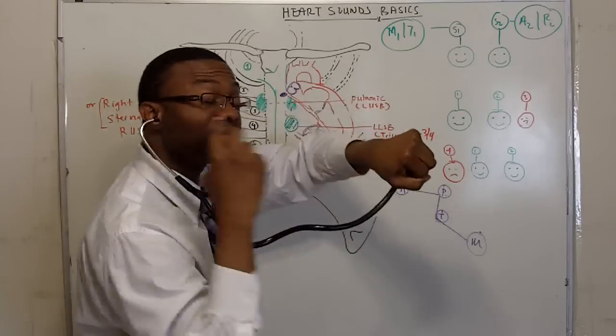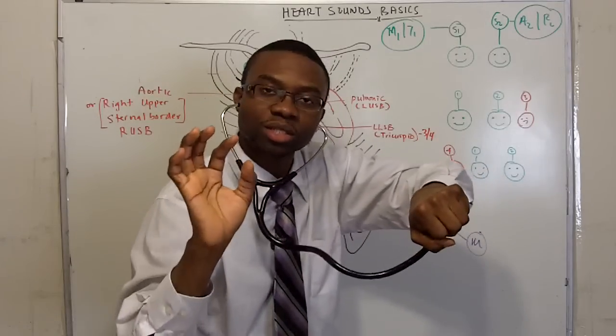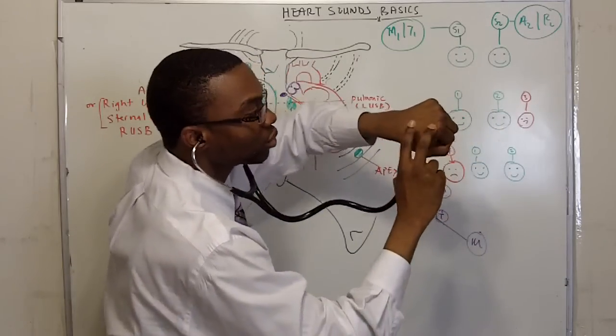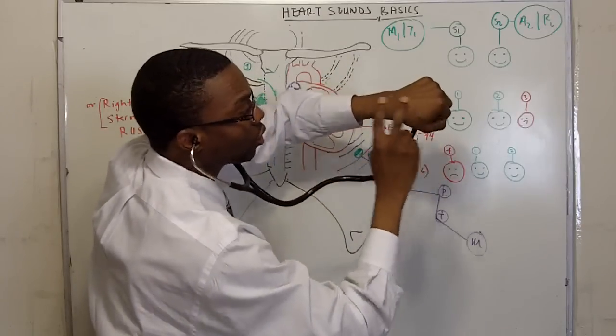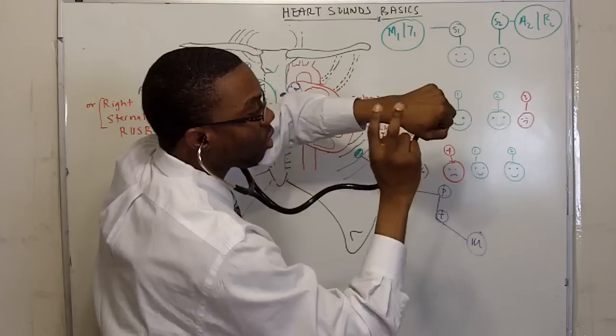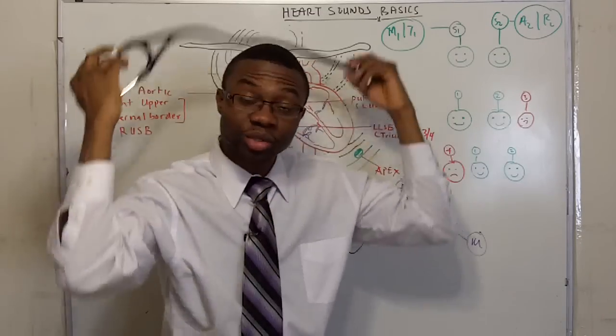Now, when you have your stethoscope, you can actually hear this inside your ears. It's like a little small subtle sound. 1, 2, 1, 2, 1, 2. So we're gonna demonstrate that on the board.